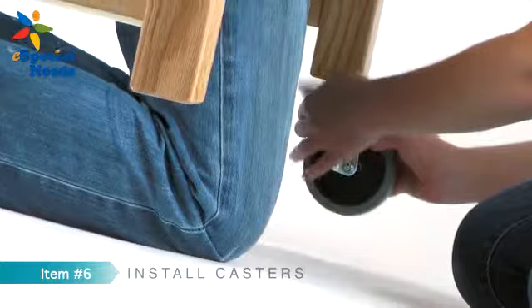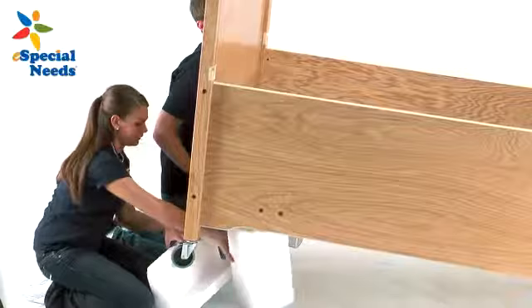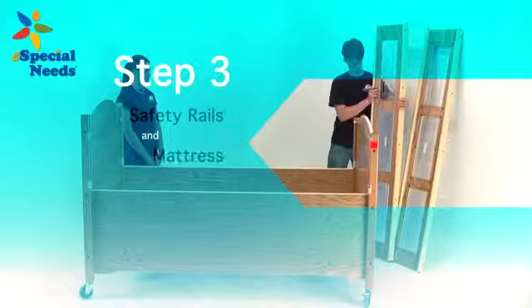Next, install the 4 casters, item number 6, into the holes at the bottom of the headboard and footboard legs. You may need to tighten the caps on the casters for them to stay in place. You may now remove the foam spacers from underneath the frame.